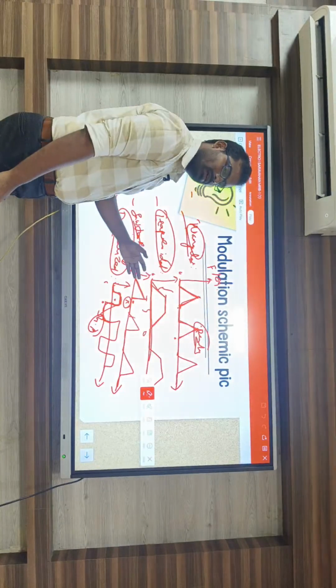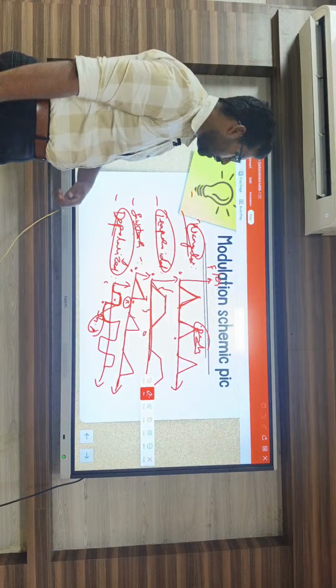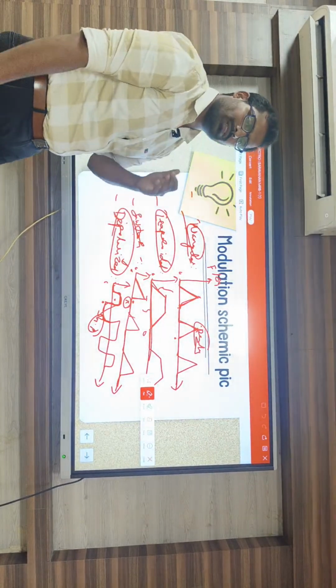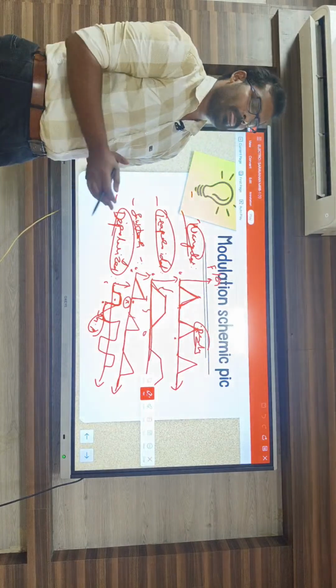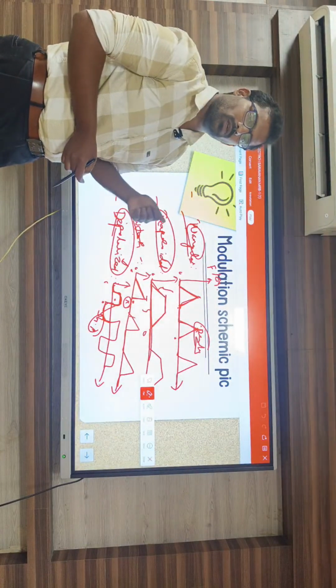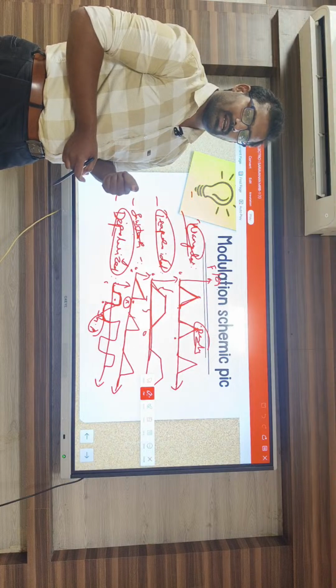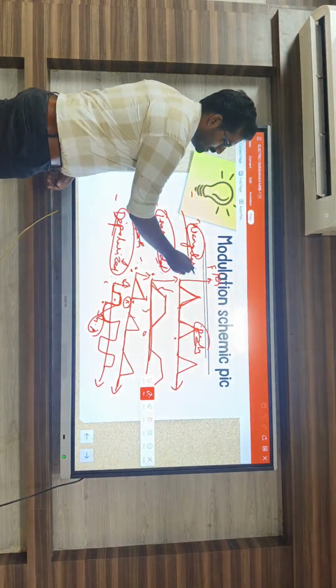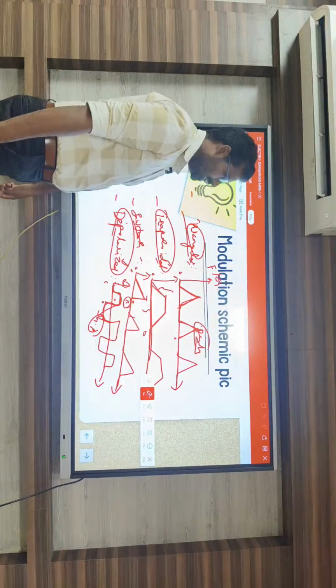That's why in the acute stage of stroke, we use this type of modulation. Once regeneration gets started, based upon MRC grading from 0 to first grade, that is the flickering contraction, at that time we change the mode from here to this type of modulations, right?